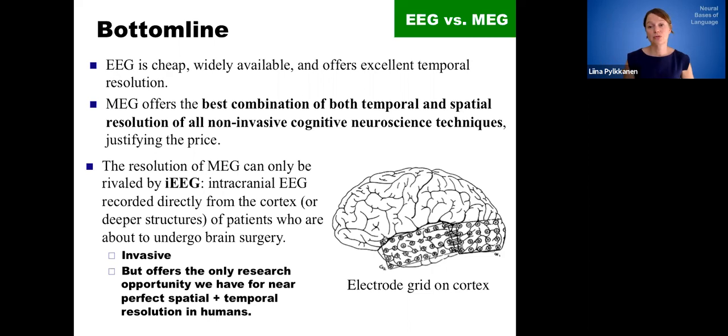And while those electrodes are on the patient's cortex, they also offer researchers the opportunity to run experiments with these patients, and therefore they can contribute to basic science in the course of pre-surgical planning. That's a literature that has better spatial and temporal resolution than non-invasive EEG, but it does occur in this very limited clinical setting.